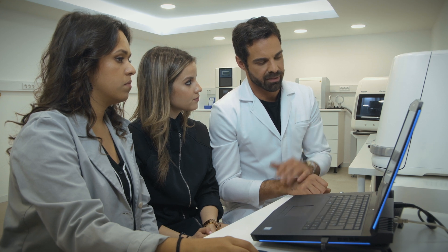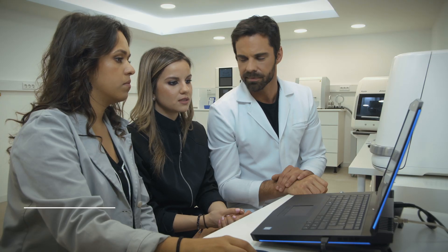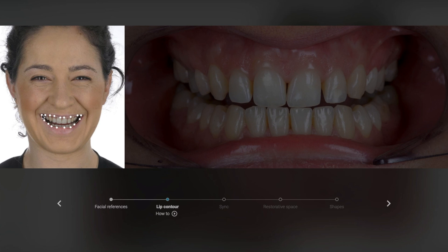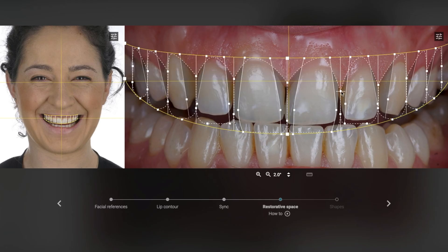Now we already have the pictures in the software, so we will start to mark the pupil lines and the smile lines, just to make a 2D smile design to motivate your patient and for them to see how it works in reality. In this case, we use the curve of the lower lip and try to equilibrate the upper smile with that curve. Then it's important to match the teeth because this patient has diastemas, and we try to match the right proportion with the face.